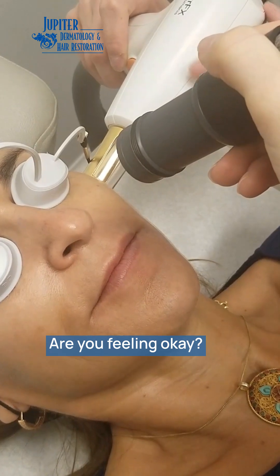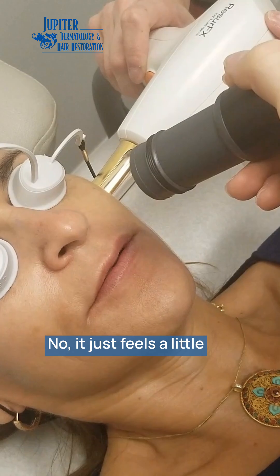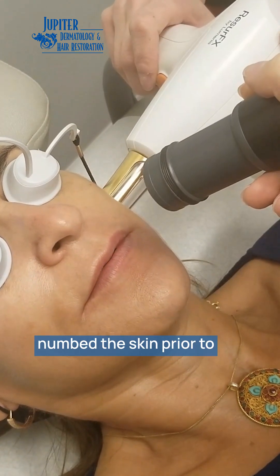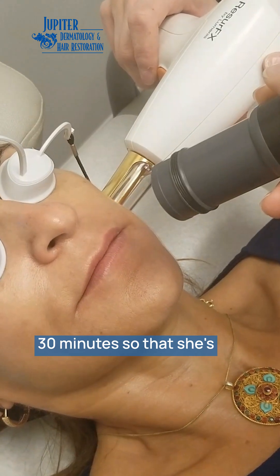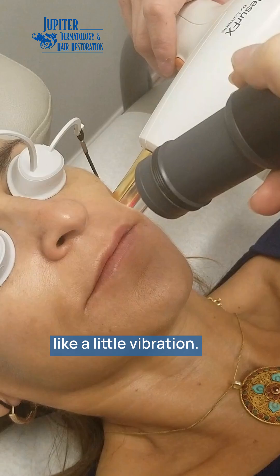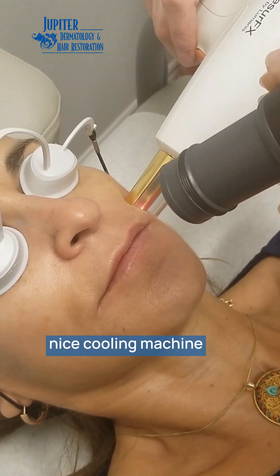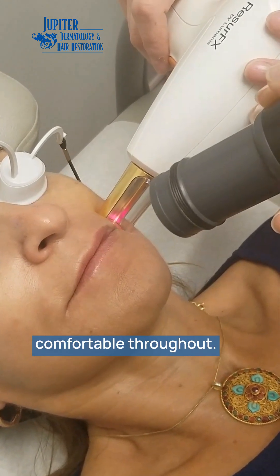Are you feeling okay? Yes. Any pain? No, it just feels a little prickly. We numbed the skin prior to the procedure for about 30 minutes so that she's nice and comfortable. It almost feels like a little vibration, and we've got our cooling machine here that blows cold air to make it even more comfortable throughout.